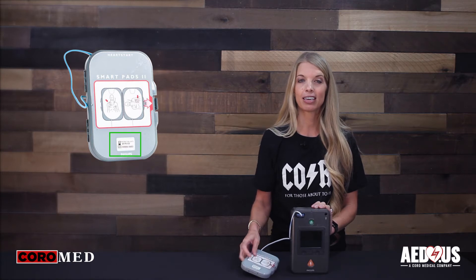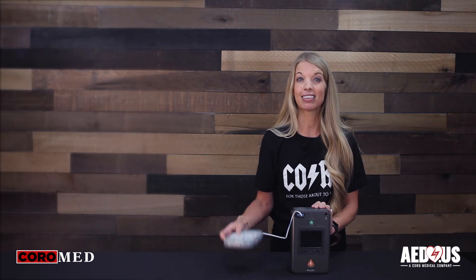To prepare for an emergency, you want to keep the electrodes connected to the unit at all times. The pads have a two-year expiration. The expiration date is located on the outside of the package. You're going to change the pads at the time of expiration or if you use the AED.